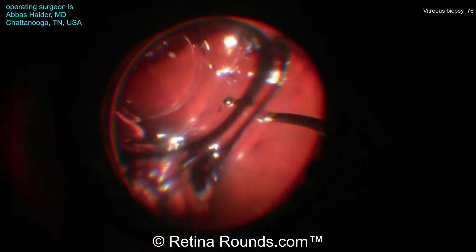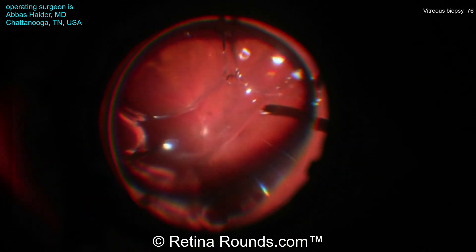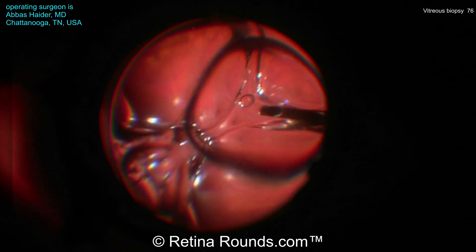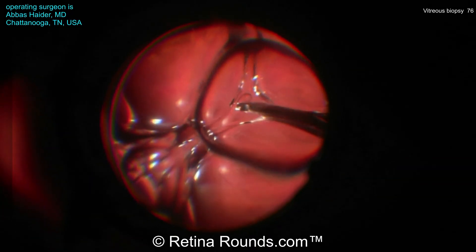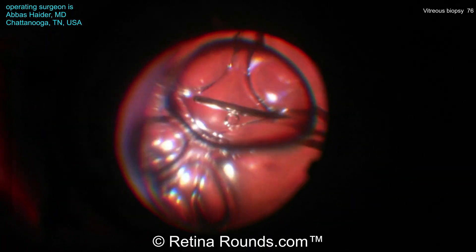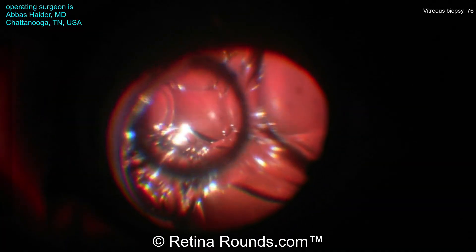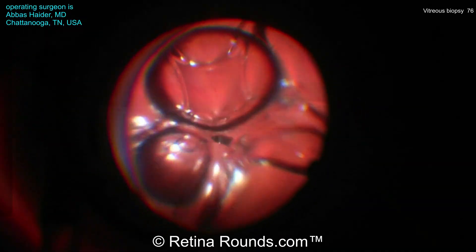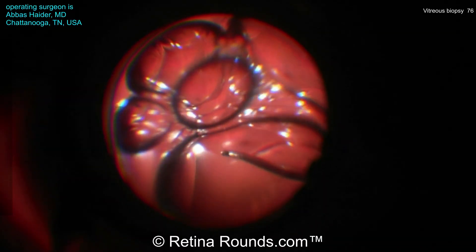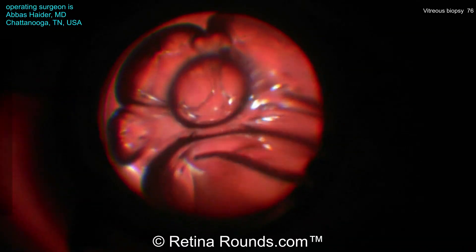Alternatively, a three-way stopcock can be used to divert aspiration from the manually aspirated syringe back to the vitrectomy machine. It's important during the vitrectomy to keep the cut rate low, typically below 1,000 cuts per minute, to decrease the risk of disruption or lysis of the cells in the vitreous sample.